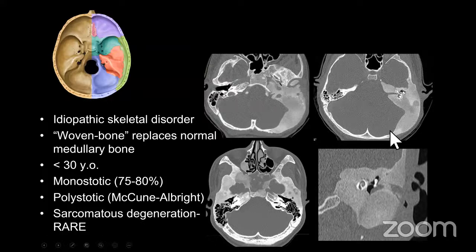And that is when you do have patients that have dysplasias involving the skull base, this is the classic example here of fibrous dysplasia. So I don't need to spend a lot of time going over fibrous dysplasia. I think you're all aware of this. But the point that I want to make is that sometimes when you're looking at patients and they come in with these ill-defined findings, you'll see something that looks like this. And you'll say, what in the world is this?